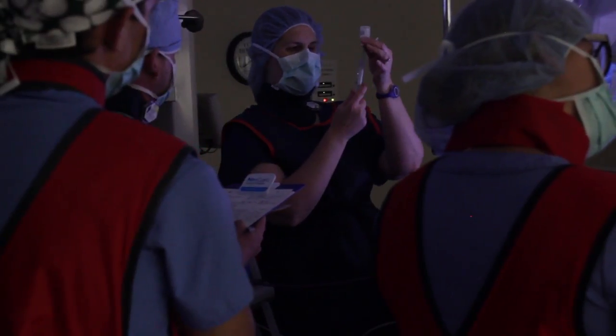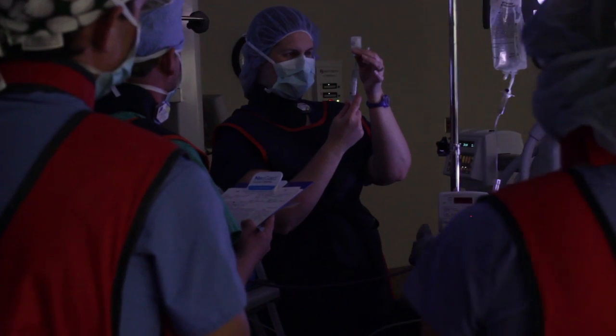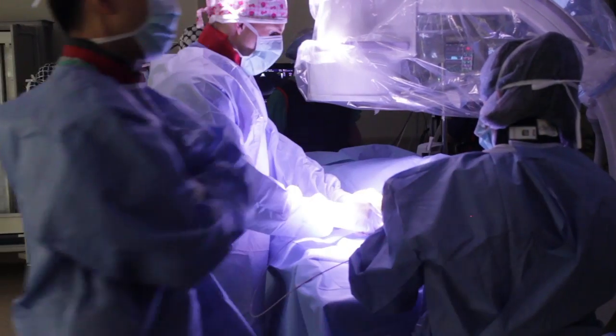Procedure-wise, it was fairly straightforward and non-eventful. Basically, we anesthetize the patient, place an introducer into one of the vessels, advance an electrode catheter into the heart, deliver a shock, and convert the atrial fibrillation to normal sinus rhythm.